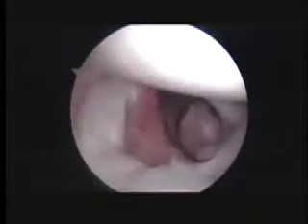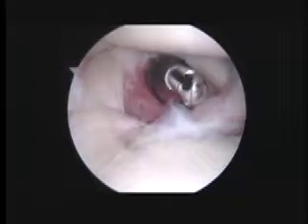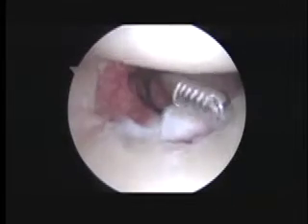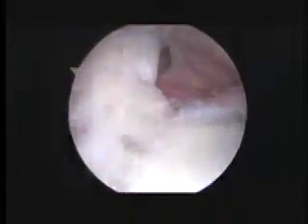We're looking from the back to the front. Everything that you see is magnified 30 or 40 times on the screen. Right now we've got a cannula coming in the front of the shoulder. The camera is coming in from the back. With this shaver instrument, we're just going to start smoothing out some of these rough areas to see exactly what needs to be done.